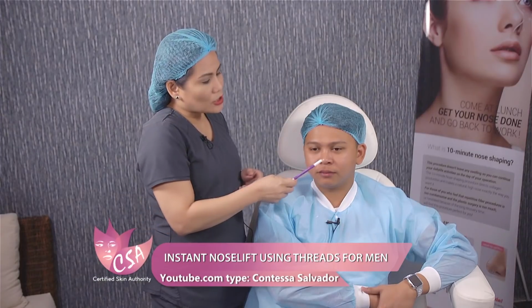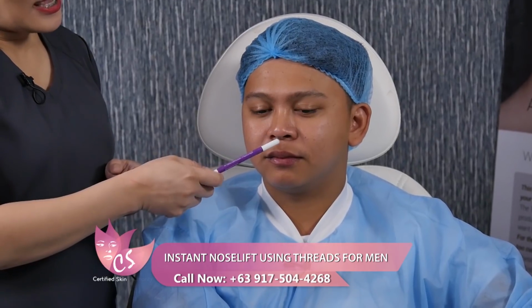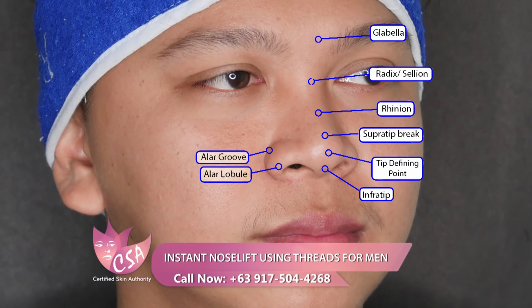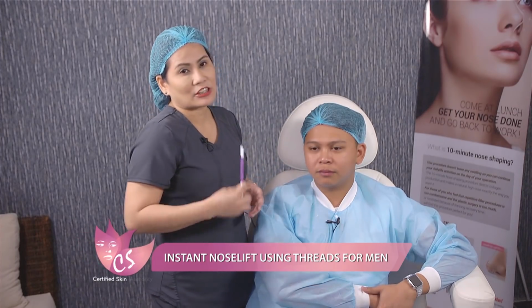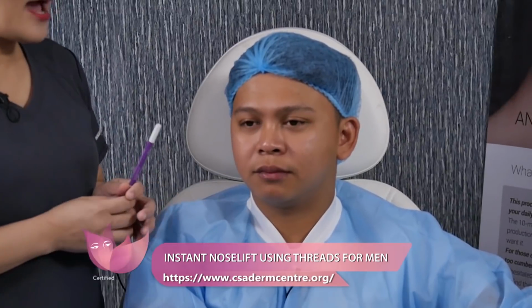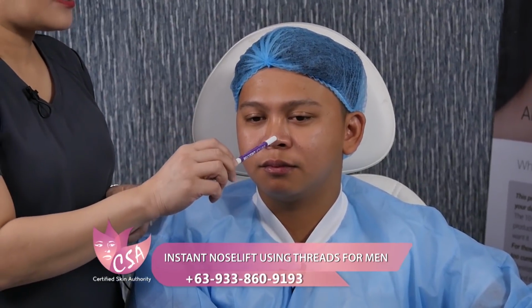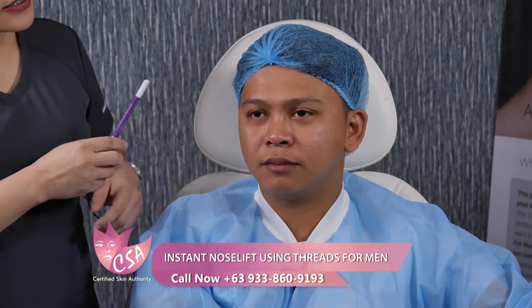Then when we come to the tip region ng nose, so we have the supratip, the tip defining point, and then the infratip. Now when I do injection para sa ating nasal bridge augmentation, I already make an entry point na dun sa infratip region. And when I do a nasal tip projection naman, I do my entry point doon sa pinaka tip defining point. So, kay Neil, we can still elevate.